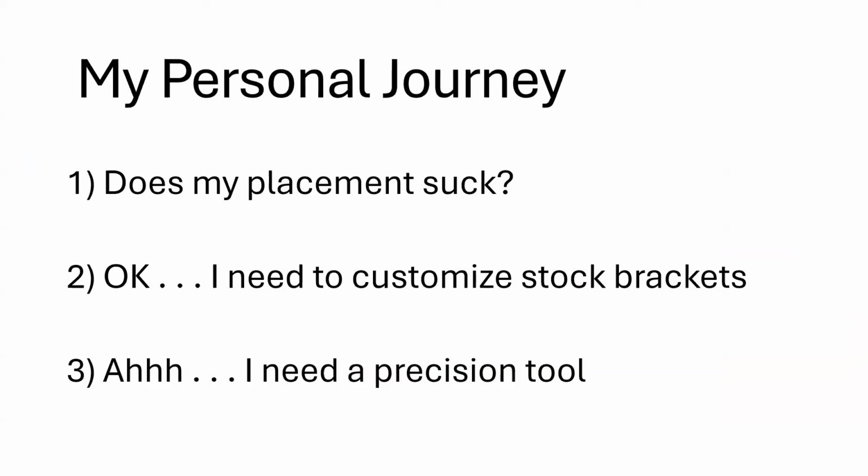And then the last part of my journey. I was going all in on things. I'm customizing my setups, spending a lot of time on them trying to get the results I want, but I still wasn't seeing it clinically. I was just scratching my head.